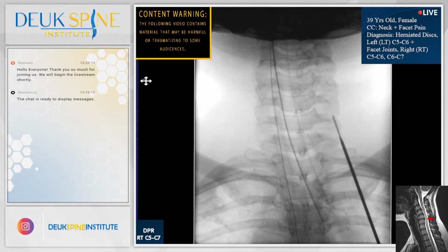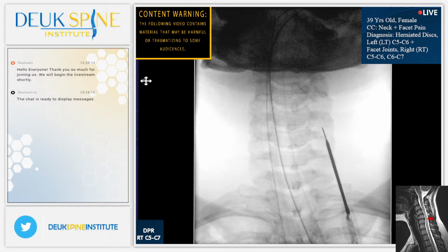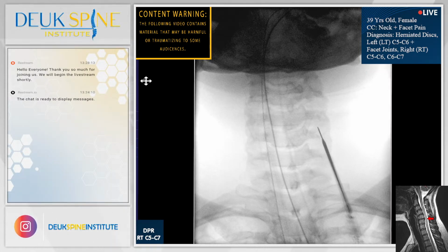Very good. All right, Dr. B, we are going to head down. Now, Henry, why don't you show our audience how this procedure works? She's facing down, correct? Straight down? Perfect. She looks like she's turned. Well, a little bit. It's not much. If you can just help me straighten her out. Because look at Jordan's x-ray. You can see the spinous process at the bottom is midline, but then at the top it's to the side. Henry, go ahead and show our audience how the facet joint causes pain. Yeah, she still looks a little rotated. Maybe it's Jordan's fluoro.